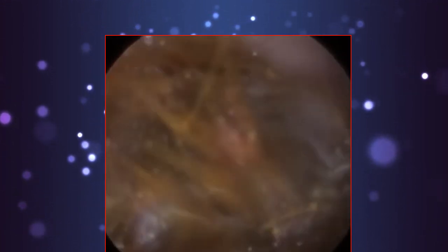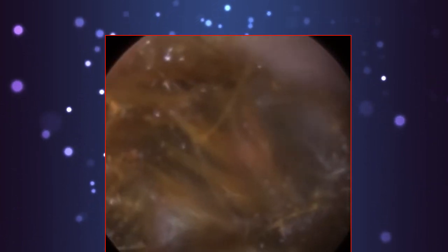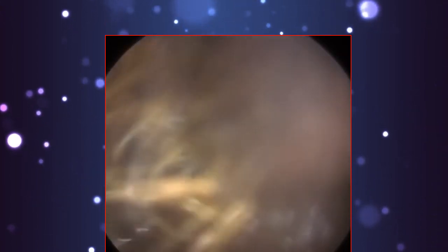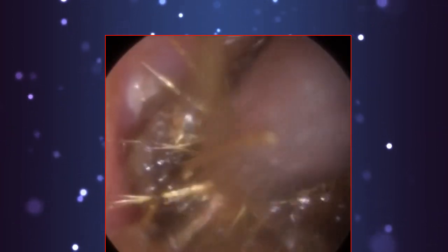See the consistency, what I was referring to earlier, like a chewing gum type of wax. The suction probe itself, you can see the mark it's made. It's not really suctioning, it's almost like a fudge type, and it's just indenting the surface of the plug of wax. And that's why if you use an ear hook or Jobson horn, it's just going to completely dice through it as opposed to bringing it forwards. You can see it's still really matted here.